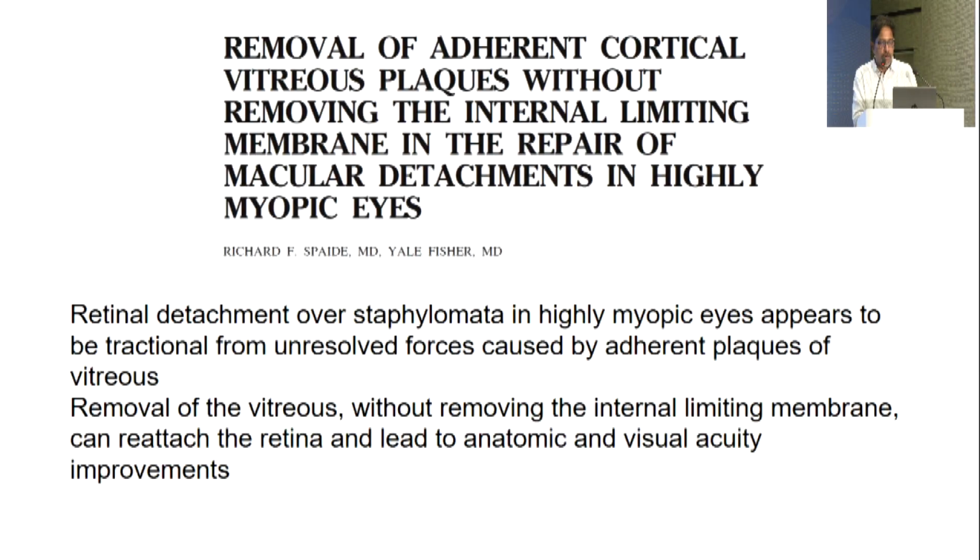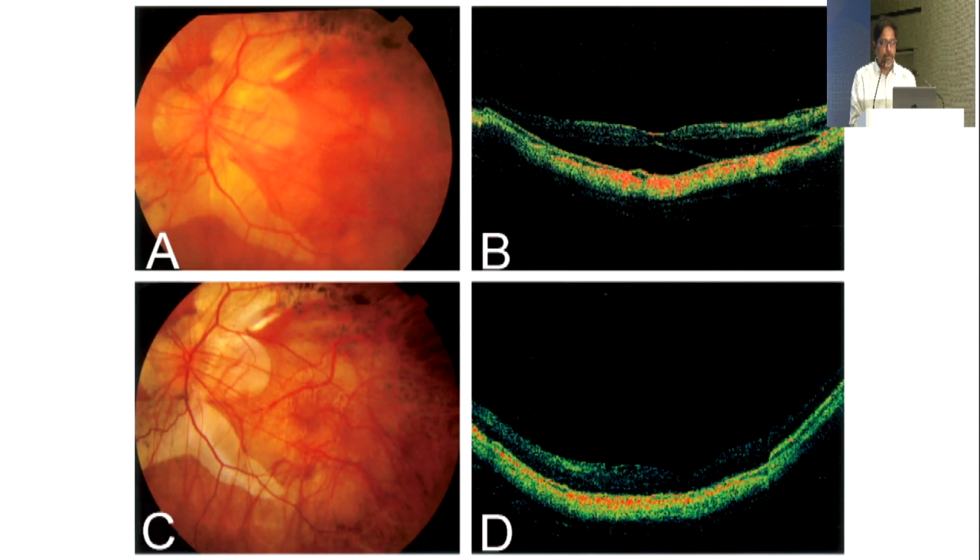So this is a short video of how to do ILM peeling. Using contact lenses also gives much better depth perception compared to routine non-contact viewing systems. Then Richard Spaide described how he identified the posterior hyaloid using triamcinolone and removed the posterior hyaloid and the schitic vitreous, but he did not do ILM peeling.